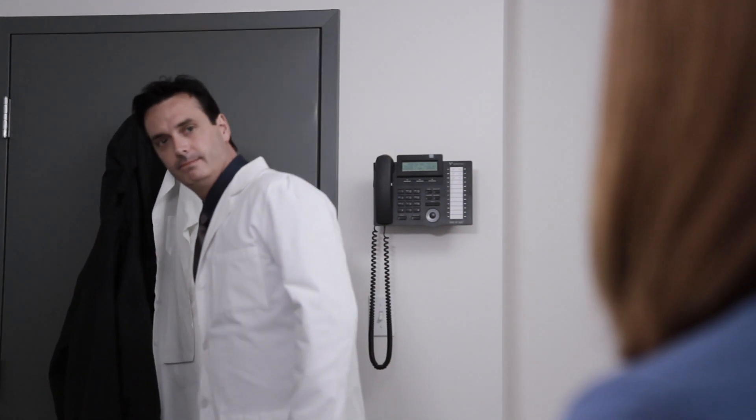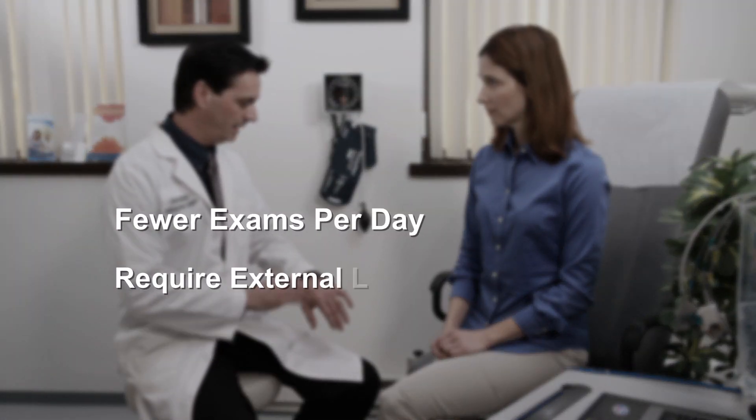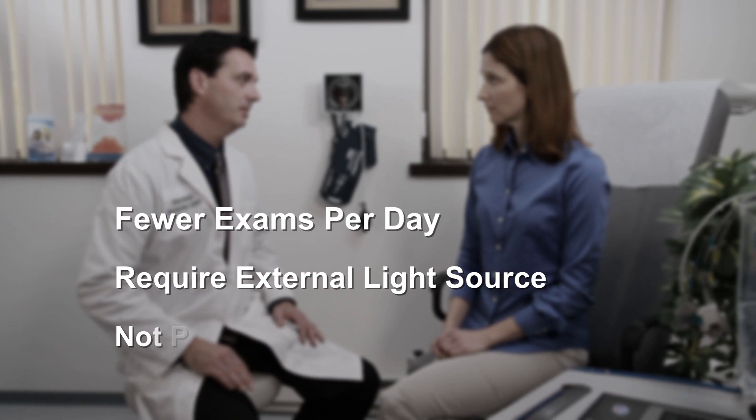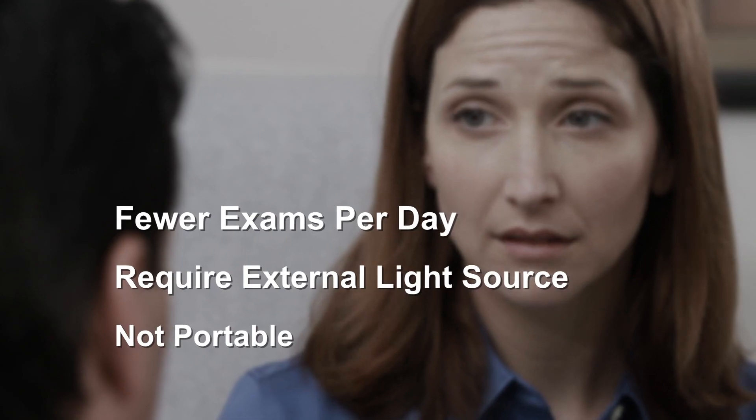Endoscopes are an essential tool for all ENT specialists, but traditional scopes have their limitations. They can be cumbersome to use, require tethering to an external light source, and are not inherently portable.